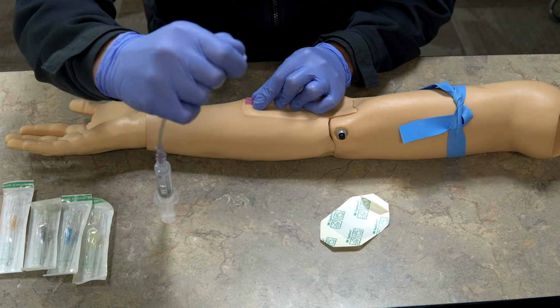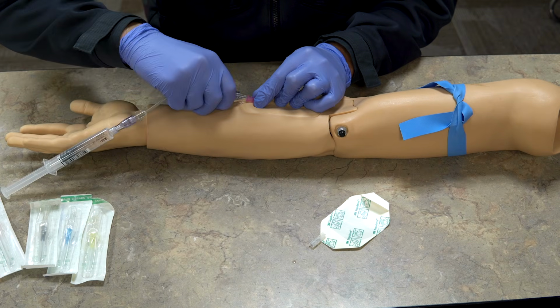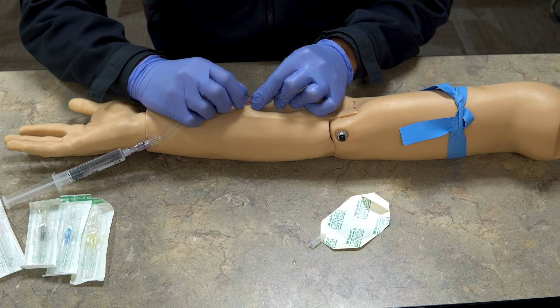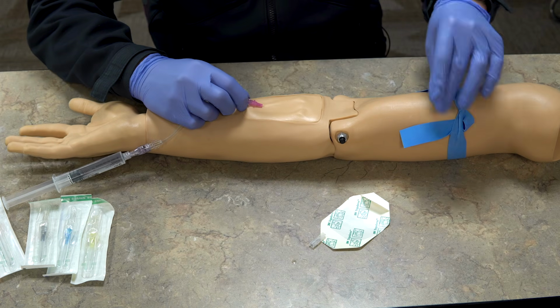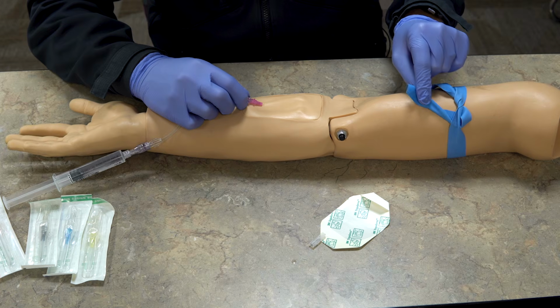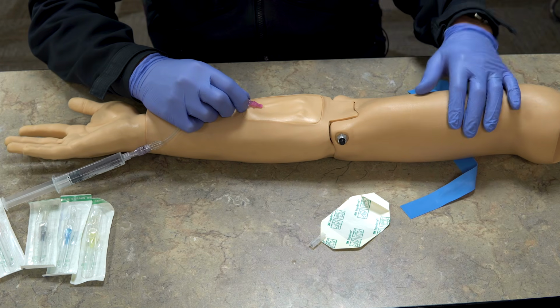Next step is I'm going to take my saline here, and I'm going to insert that and tighten the luer lock down. And now I can stop holding tamponade, and I just hold that in place. Come back to the tourniquet and pull the tourniquet off, and that's going to restore all the normal blood flow to this arm.